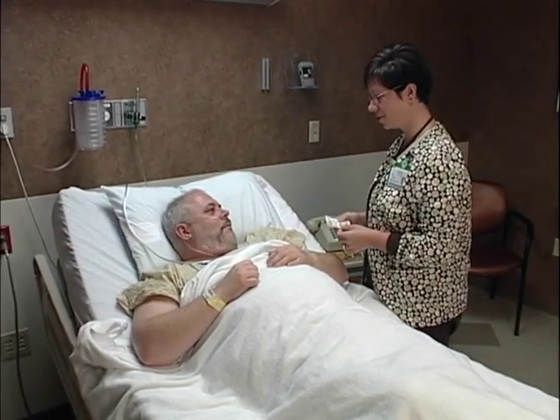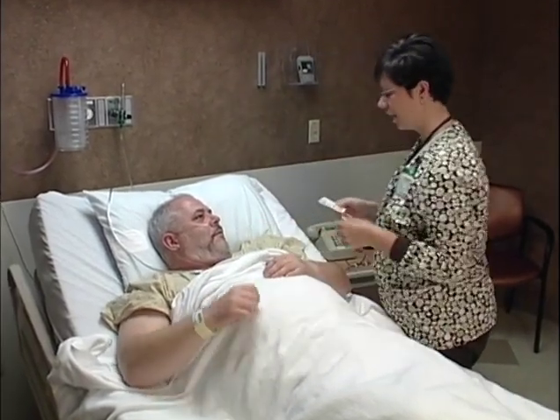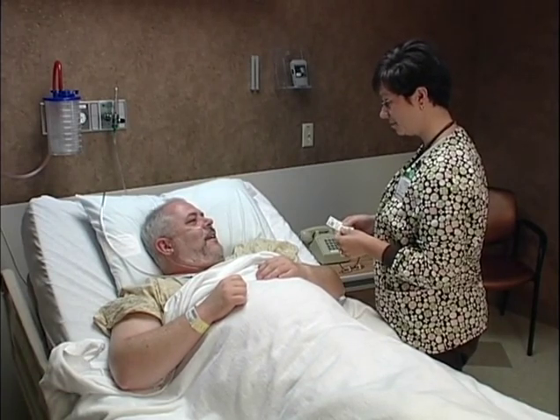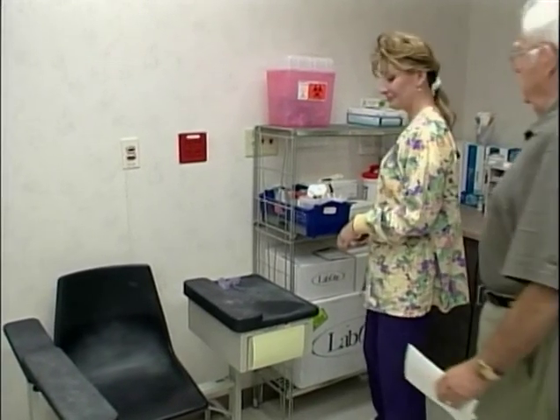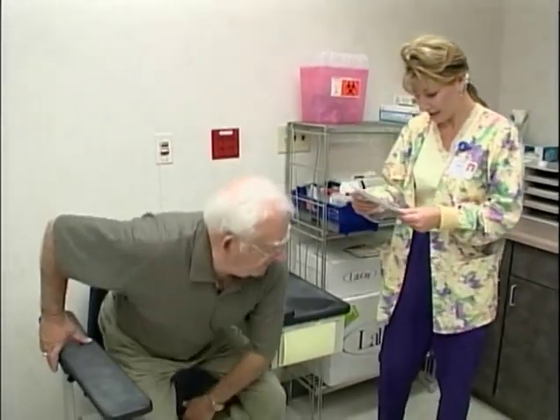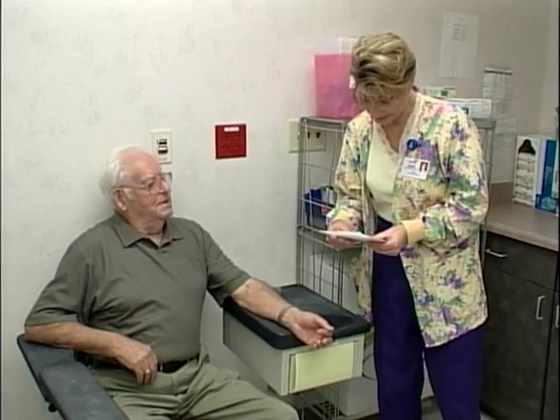Inpatients should be asked to state their name, address, unique identification number, and/or birth date. Compare the information given with the information on the requisition or pre-printed label, as well as with the patient's identification bracelet, which must be attached to their person. Outpatients should be asked to state their name, address, unique identification number, and/or birth date. Compare the information given with the information on the order and requisition. Resolve all discrepancies before drawing any patient.